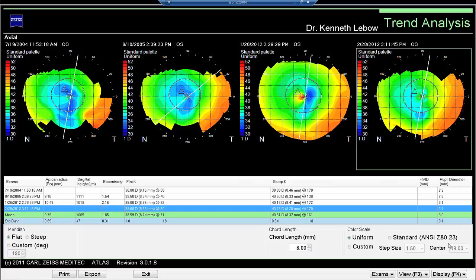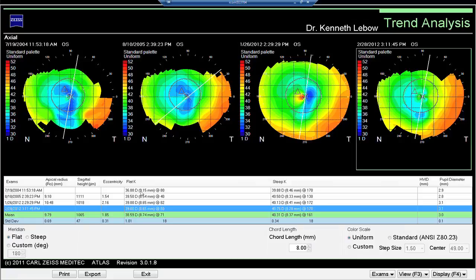In the second image, something changed — the meridional axis shifted to about 40 degrees, where previously with the other three images it was at about 80 degrees. Something different happened, and you can now look at the eccentricity values, sagittal height values, apical radius values, flat K, and compare mean values with standard deviations so you know how much change over time this individual is experiencing.